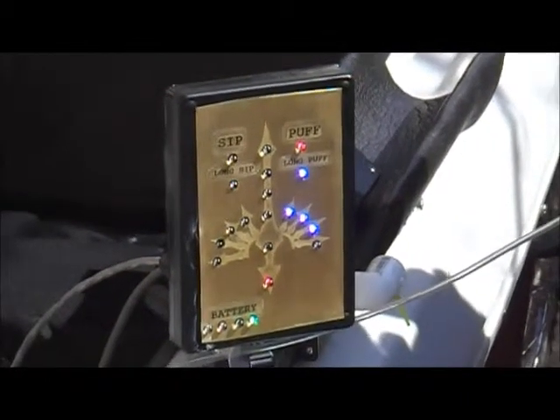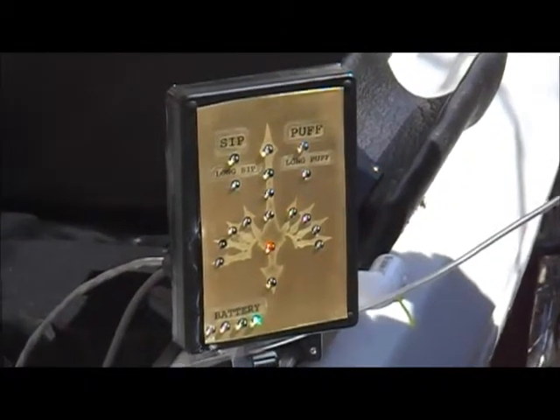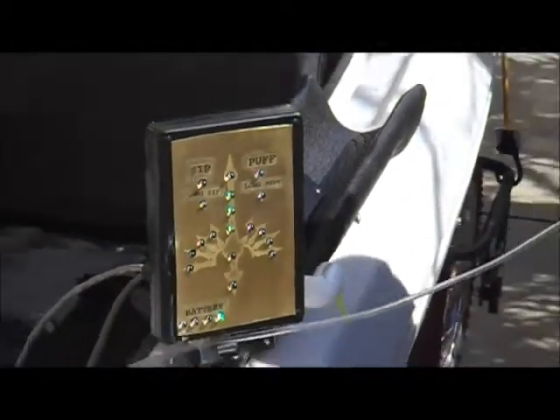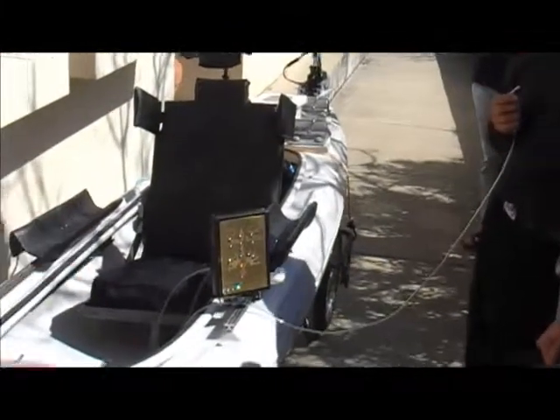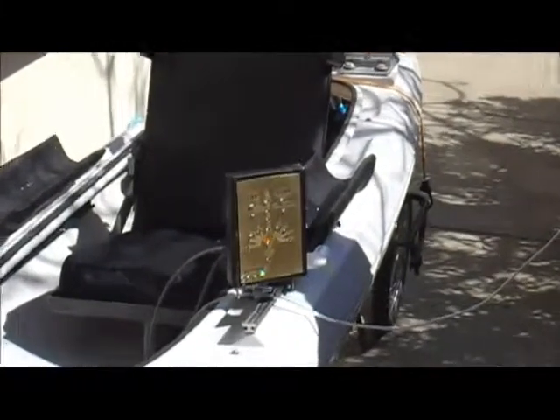We made this as user friendly as possible. We have the exact same connector which is easy to hot swap between the sip puff controller and the joystick, so you can put multiple people through this boat throughout a given day and service multiple users. We've also included a battery meter up front so you know exactly how much power you have left for the rest of the day.